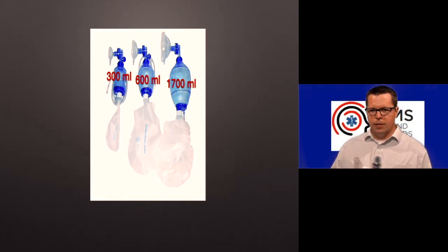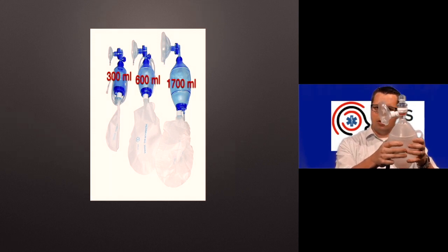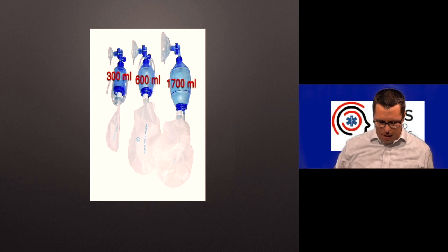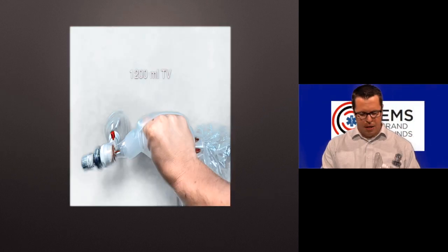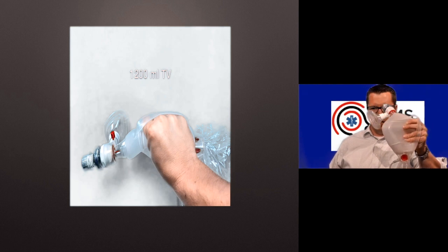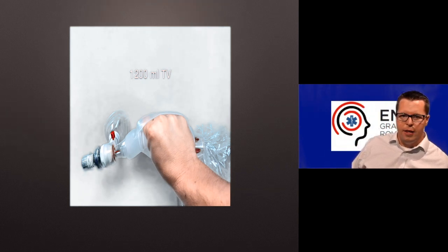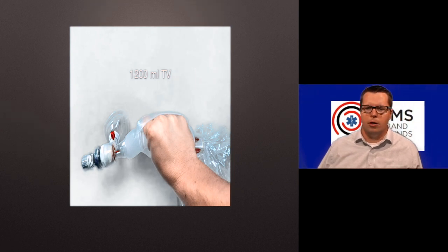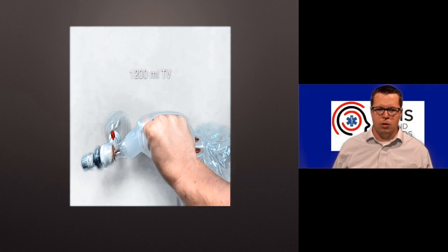Now, you see people all the time out in the field or even in the emergency department or wherever, they squeeze the bag, okay, I'm going to do this, and you squeeze the bag each time. How much do you actually deliver when you squeeze the bag like that? If I take this in my big old meaty paw here and give it a good squeeze and basically squeeze out all I can, which most people do, then you get about 1,200 mLs of tidal volume each time. And this is based on actually putting it up to a volume meter and measuring how much goes in.